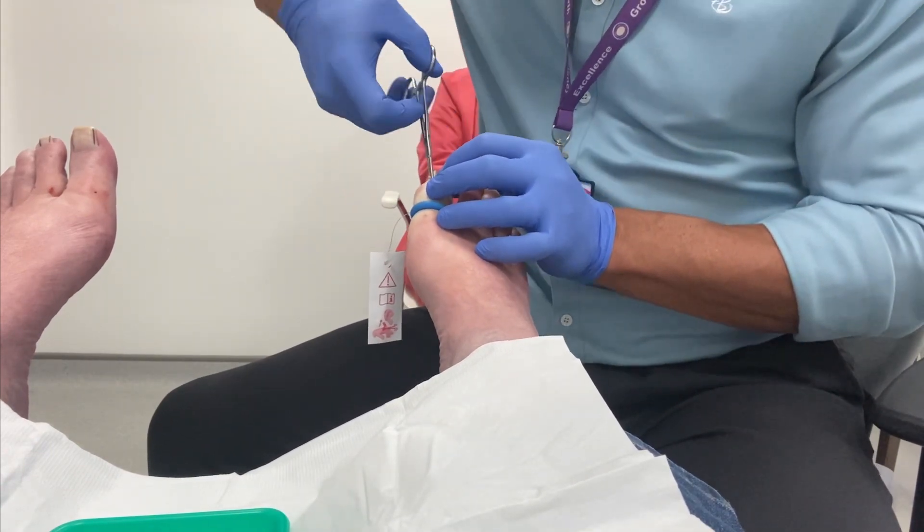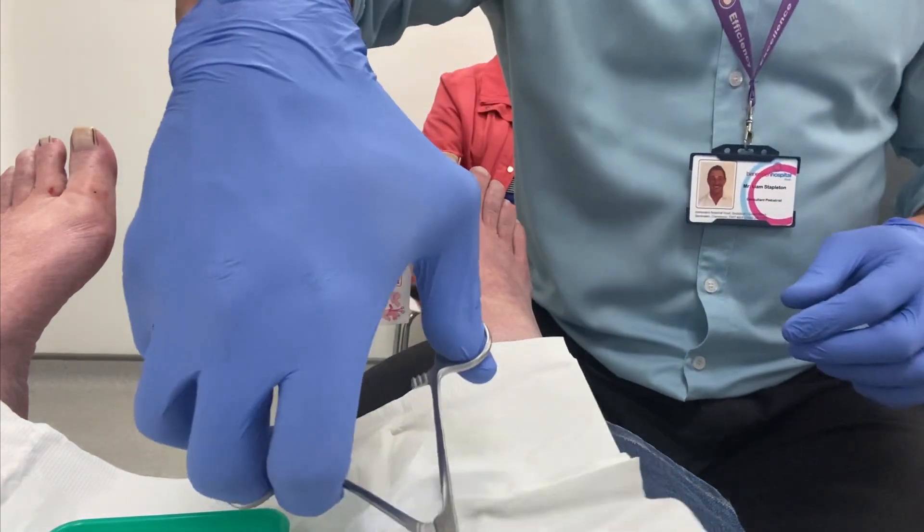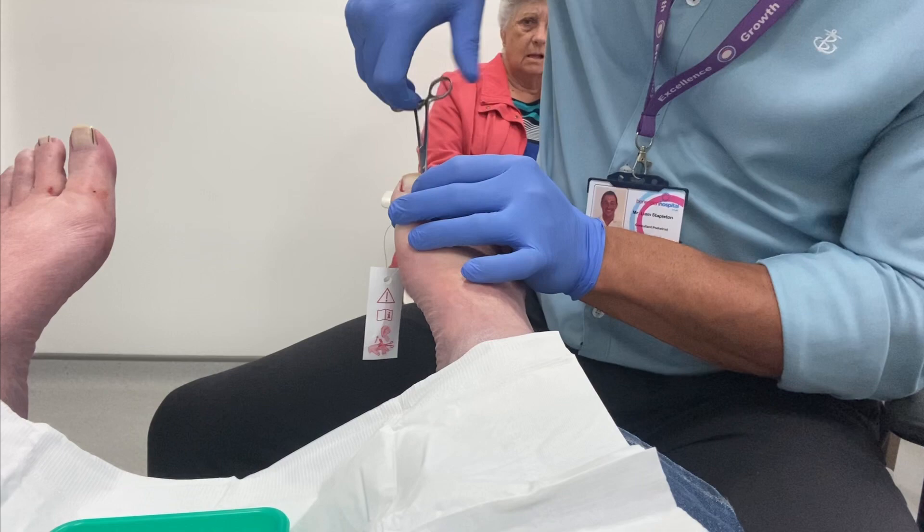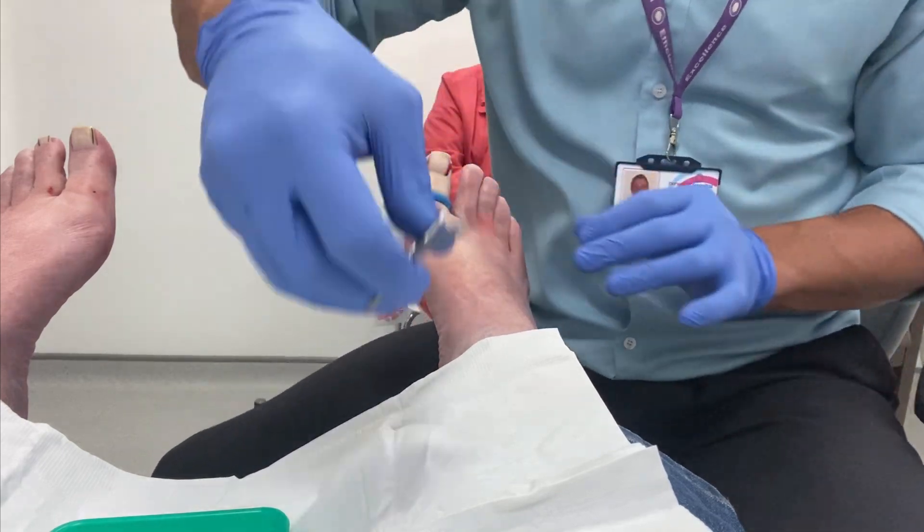Once the nail has been cut and separated, it twists out. The twisting movement here helps reduce the risk of the nail breaking.